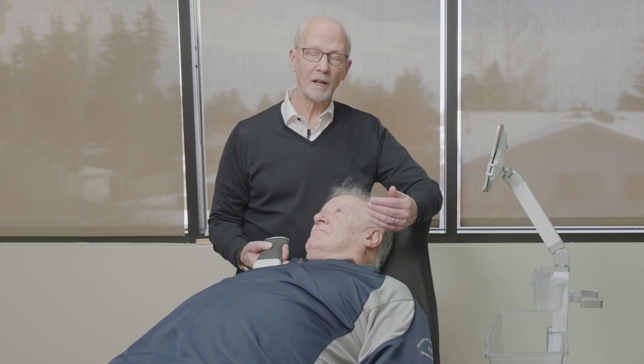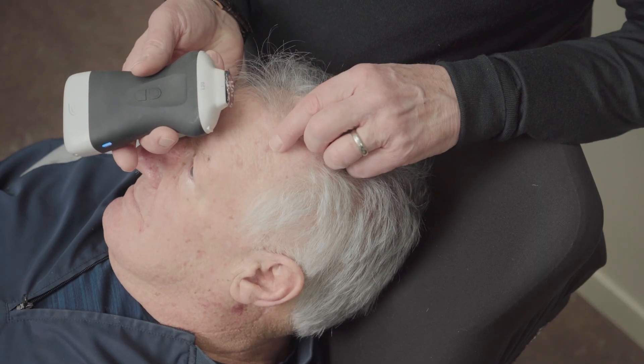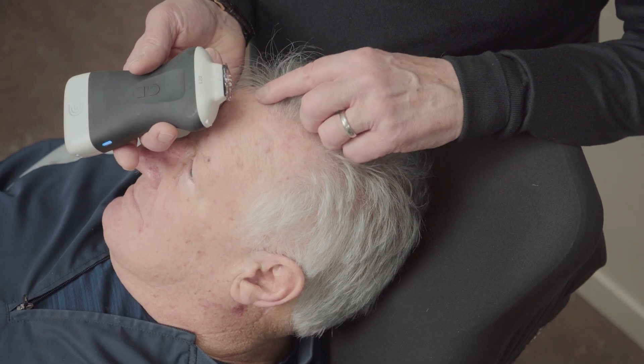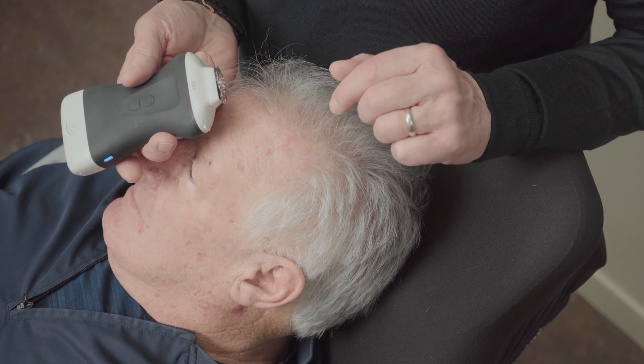So we're going to look first at the one on the temple. It's this little spot right here — you can see a little pearly papule. We can see he's had a number of actinic keratoses, and maybe we'll look at those as well.